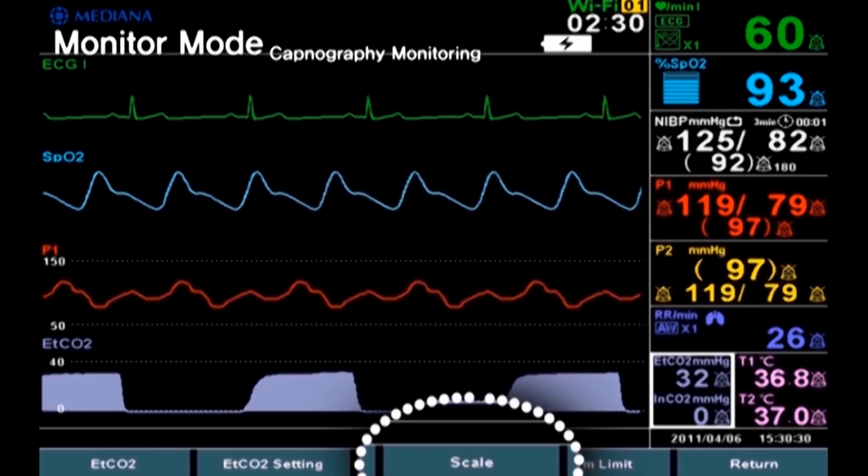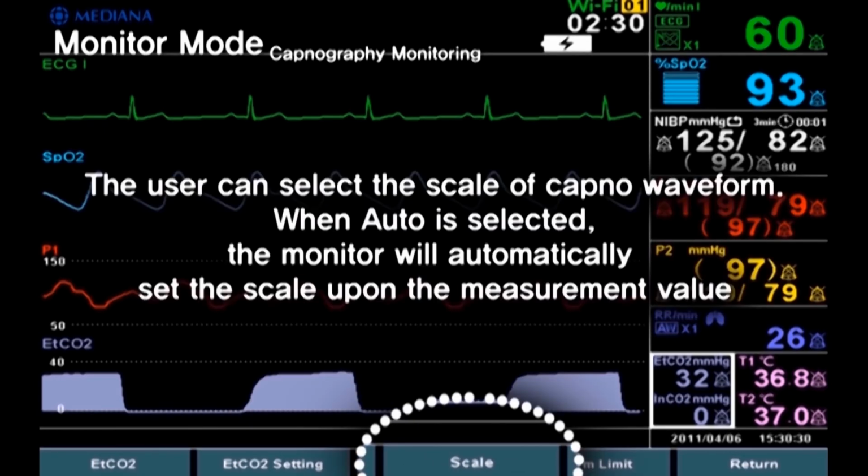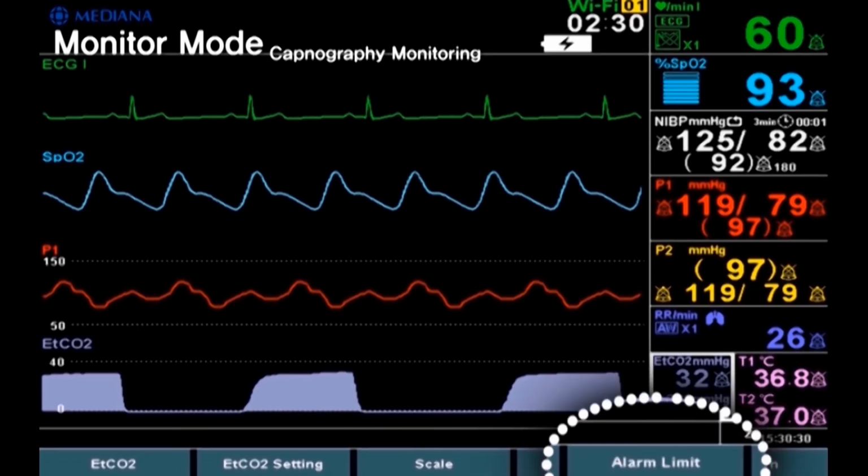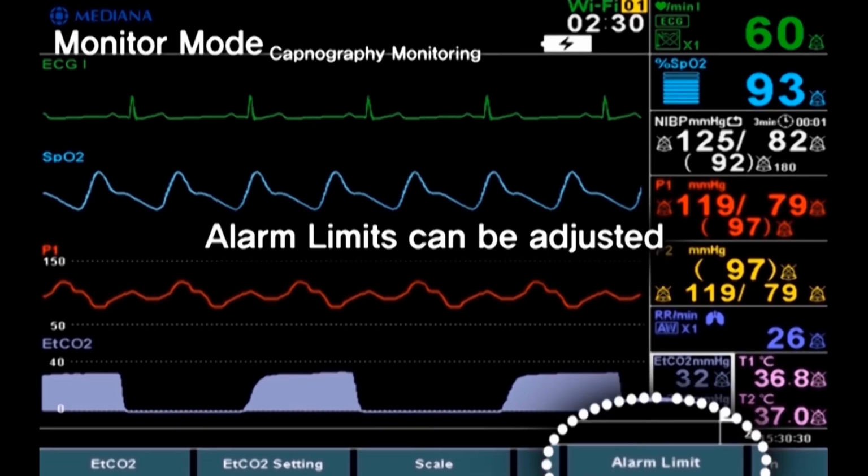Number 3. In scale, the user can select the scale of capno waveform. When auto is selected, the monitor will automatically set the scale upon the measurement value. Number 4. Alarm limit. The alarm limit can be adjusted.